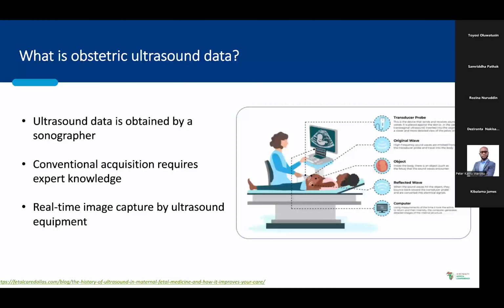The probe generates sound waves, which have very high frequency, so-called ultrasound, and the sound waves move through the tissues of the child as well as the mother, and the waves that are reflected from the surfaces of the tissues are actually captured in the imaging.